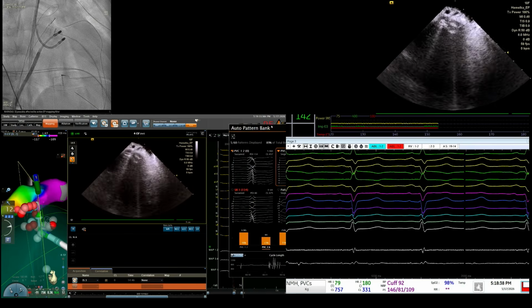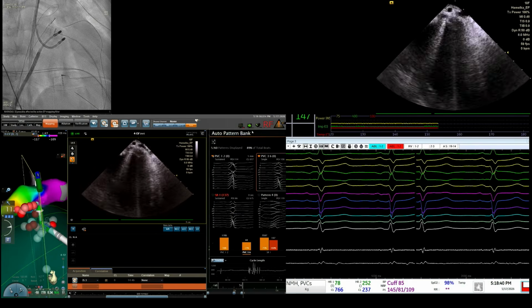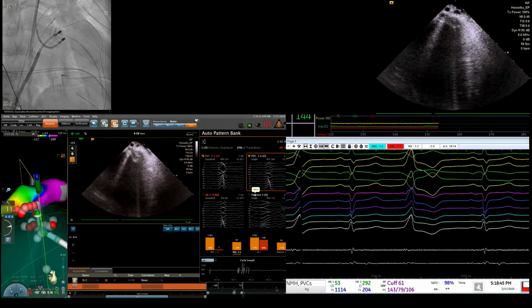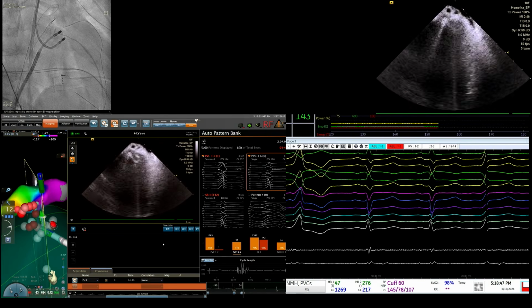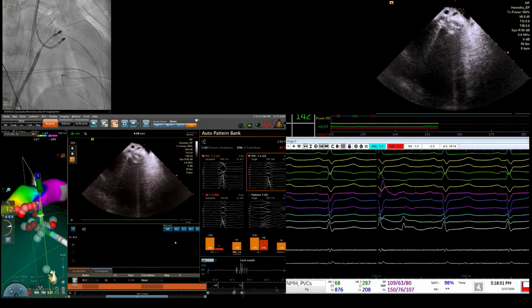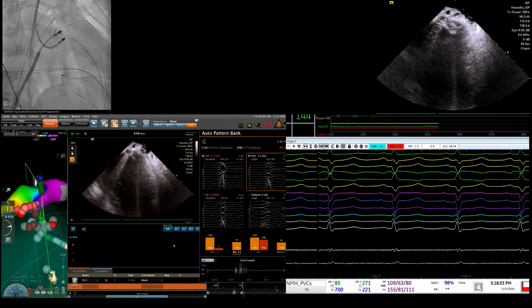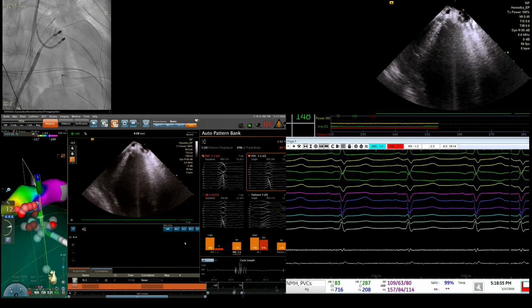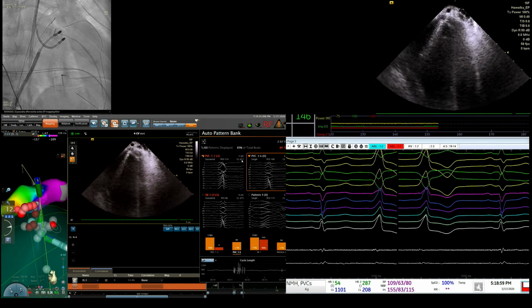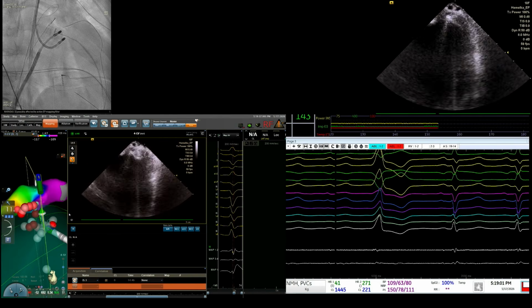And Fermin, what was the opposite side? Was it below the left cusp or close to the aortomitral continuity? How would you describe this endocardial side? No, this is a catheter. The opposite looks pretty normal. You can show them when we ablated. Actually, look at this.